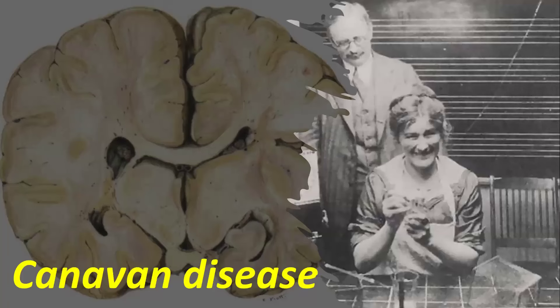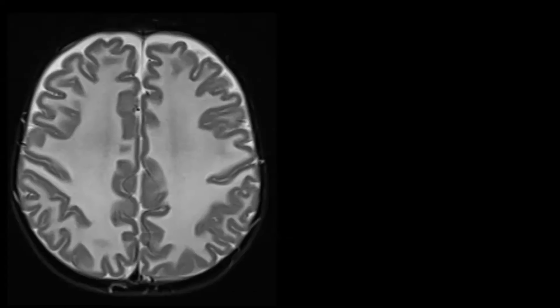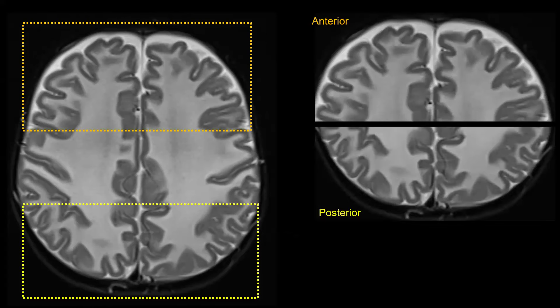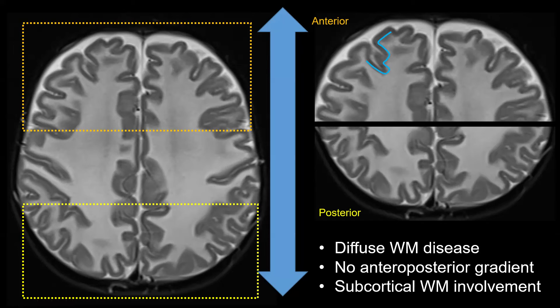Canavan disease is also characterized by diffuse white matter abnormalities. Looking at T2 weighted images of the supratentorial brain parenchyma of a very young child — probably performed during the first months of life. Comparing the frontal and posterior regions, we see no difference — so there is no gradient, which is very important in distinguishing it from Alexander disease. We also see involvement of the subcortical U-fibers. To summarize: a diffuse leukoencephalopathy with diffuse white matter abnormalities, but without a gradient and with subcortical U-fiber involvement.